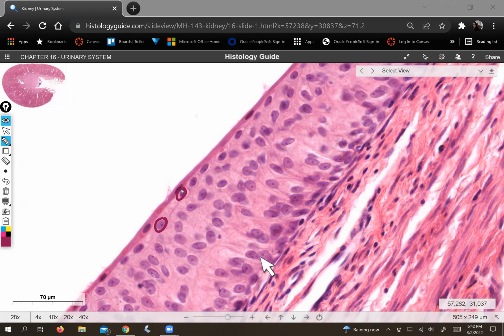So in relaxed urothelium, these cells at the top, which are called umbrella cells, you can even tell that they're a different color. In a relaxed urothelium, the umbrella cells have kind of this domed shape because they've been allowed to elastically recoil to their original shape, which is capable of being stretched, but is not currently stretched.